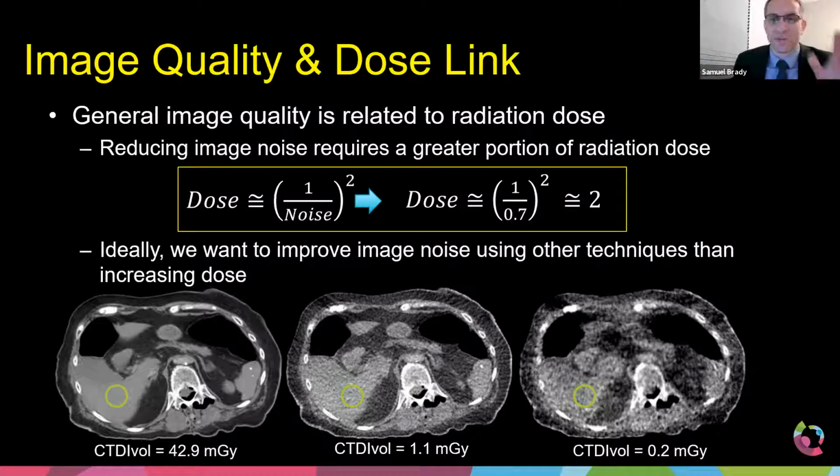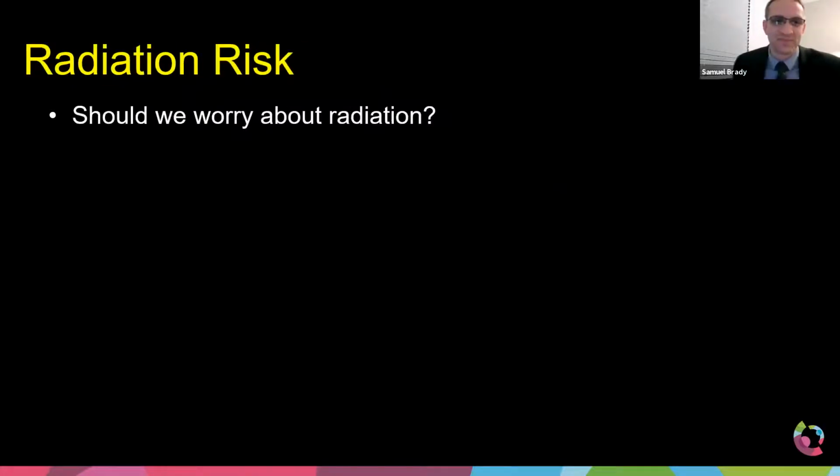But ultimately, I just want to leave in your mind, and I know you know this, that if the image is not as good as you want it to be, oftentimes the answer is not to just turn up the radiation dose. That is usually not the right answer.